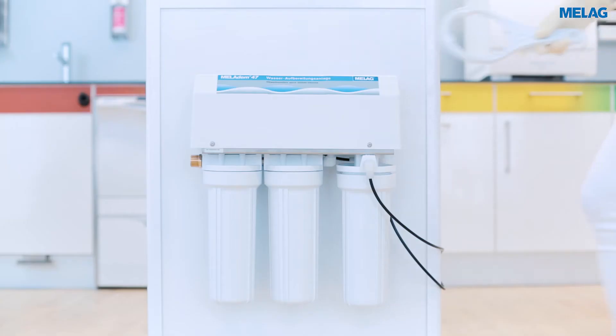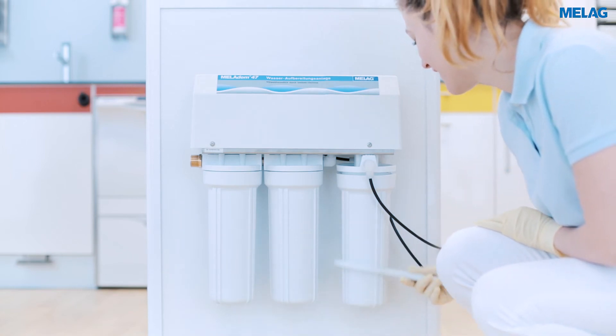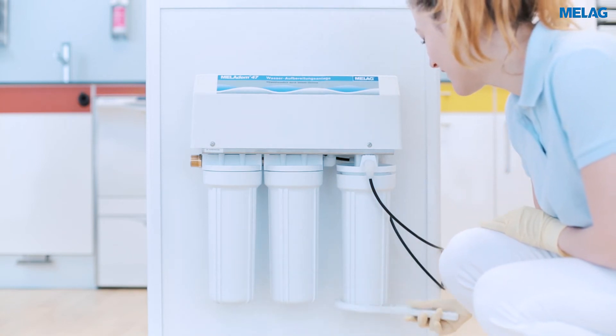You can open the right cartridge container by using the wrench. Please slide the wrench over the container and then turn it clockwise.